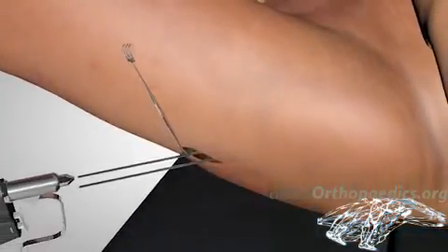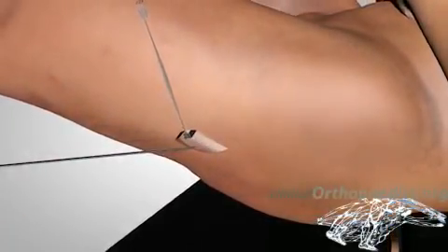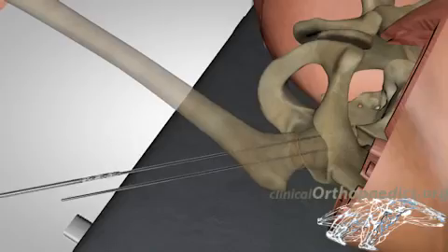The guide wires are finally removed, and the fascia, subcutaneous tissue, and skin are closed successively. Correct position of the screws is confirmed.